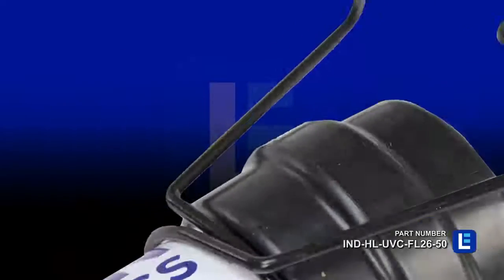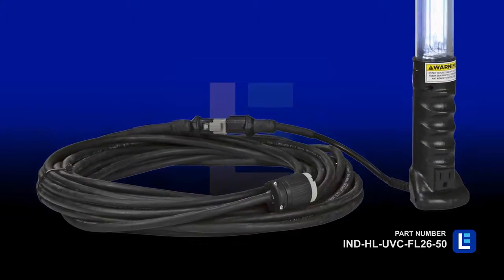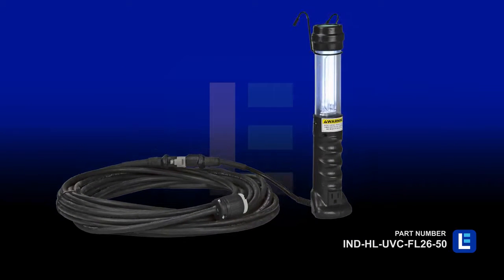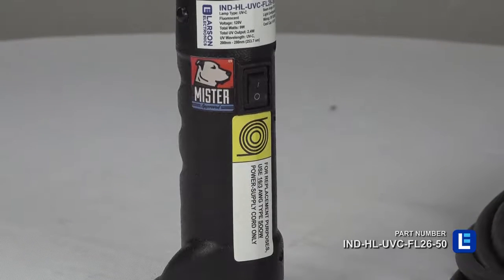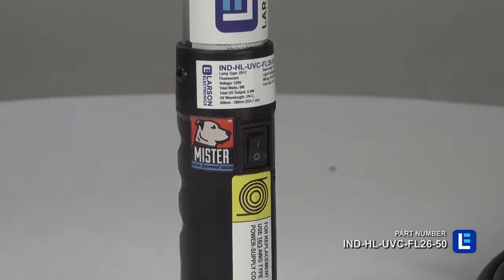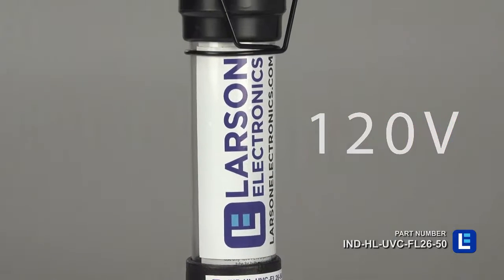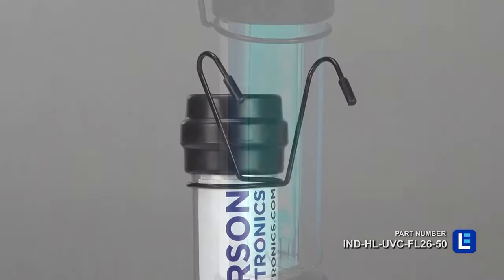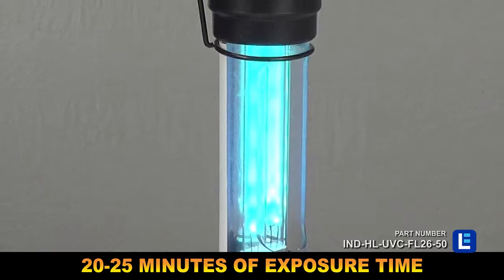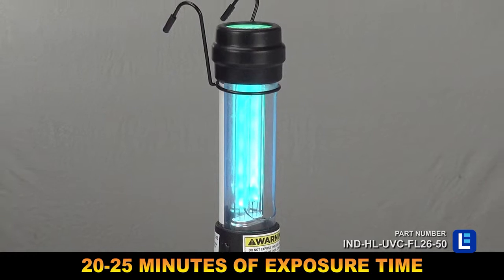Equipped with a swivel hook for hands-free operation, this UVC light features 50 feet of 16-3 SOOW cord. It has an expected lifespan of over 8,000 hours and emits a flood beam pattern. This UV system operates on 120 or 220 volts and offers 180 degrees of coverage with a recommended 20 to 25 minute exposure time for viruses.